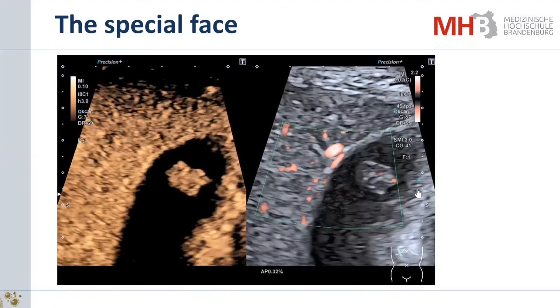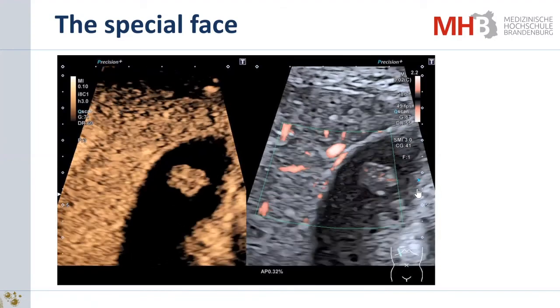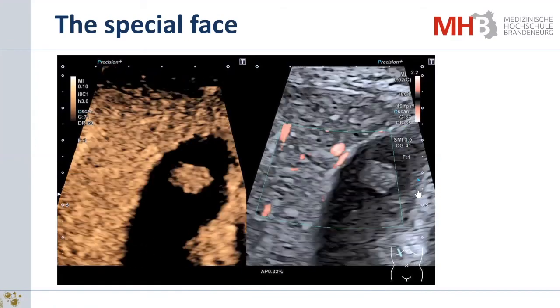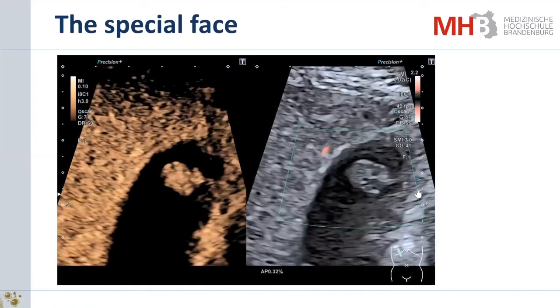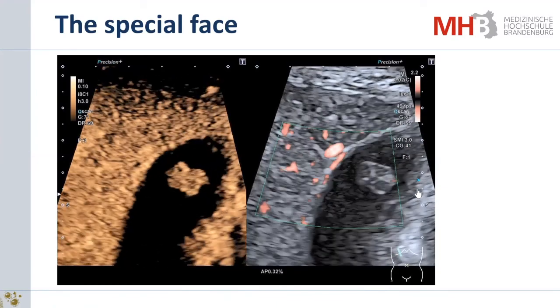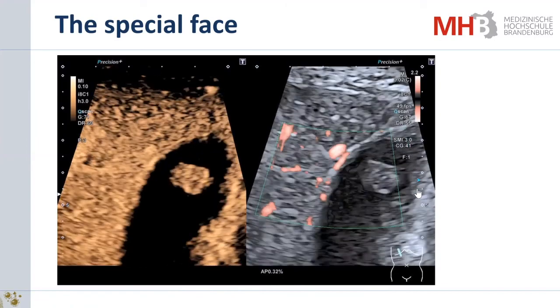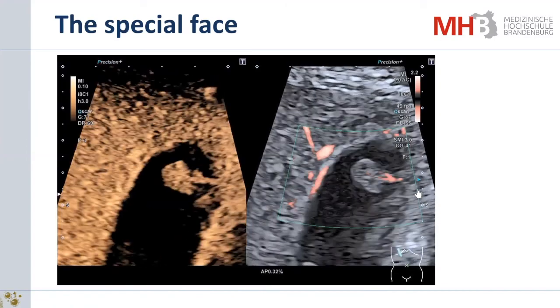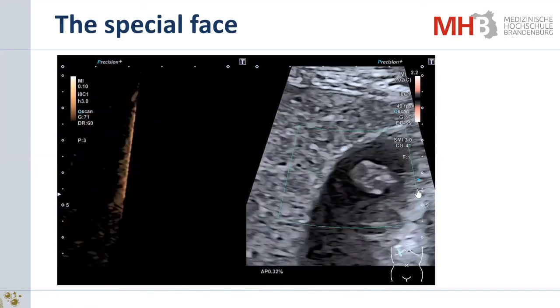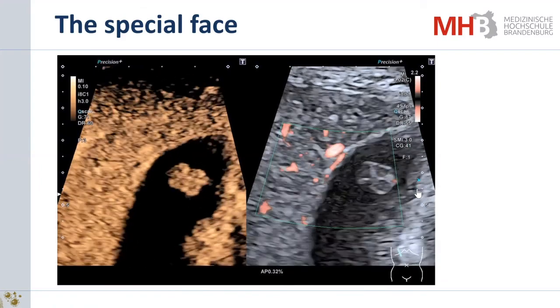Some of our participants described some very small cysts inside, and I think those are the vessels. Do you agree? I don't know. The patient is not operated yet. We decided to send him to surgery, but now is Corona time and he decided to wait a little bit. Maybe some of these anechoic or hypoechoic areas are vessels, but maybe others are cysts.